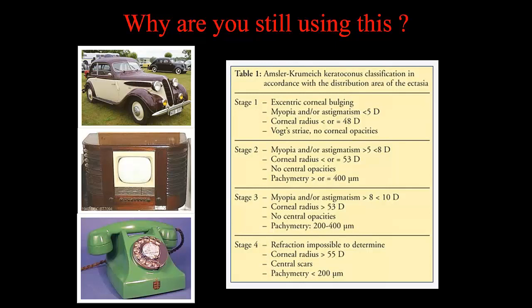First of all, it dates from 1947, I think. If you notice the pictures on the left, that was also from 1947. None of us use that. I don't know why we're using the thing on the right. It predated topography. It obviously predated tomography. It was based on a keratometer and an optical pachymeter. There's nothing else in medicine that is staging diseases on a 70-year-old system.